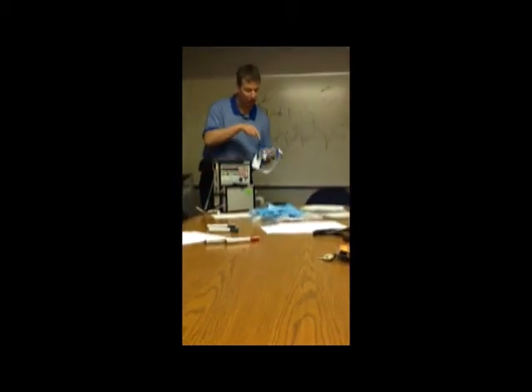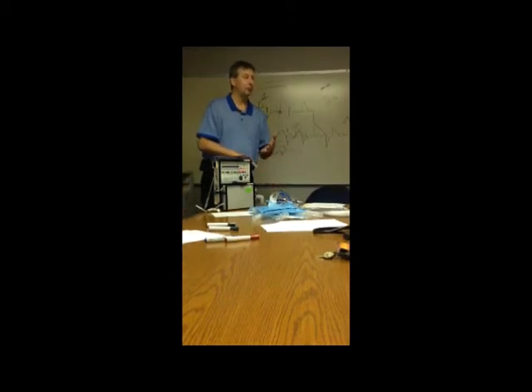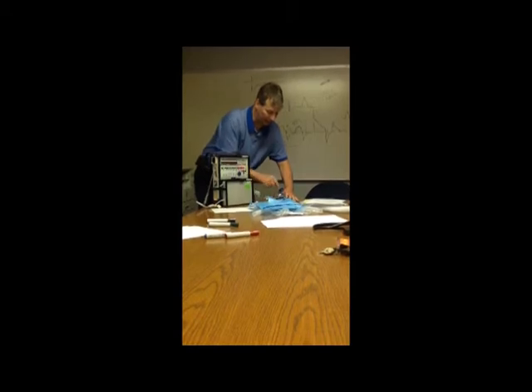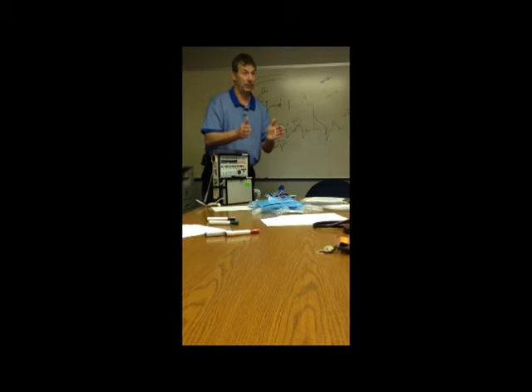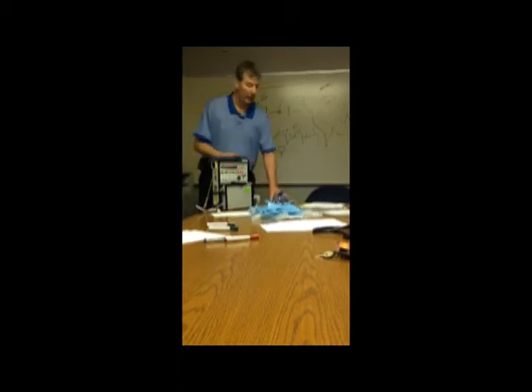Okay? And the way you can tell if it's working, this ain't a great way, but in an Ambu bag, if you look down right into the port from the backside, there's what's called a duckbill valve. It opens, and you can see that it's open. That is a great way to count your patient's respiratory rate, too. If you're bagging them or you're holding it on their face, and they're breathing spontaneously through it, I can see every time they take a breath, and how big it is by how long the thing's open.